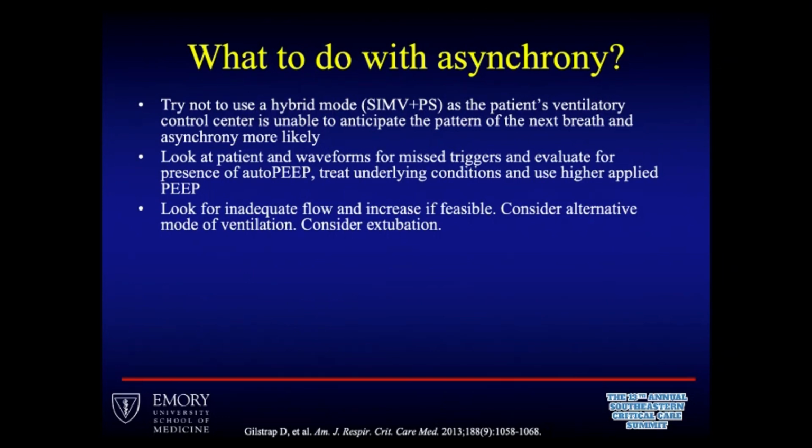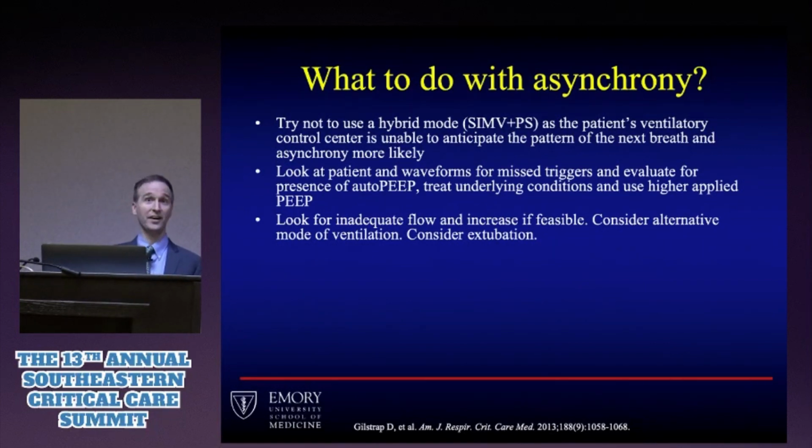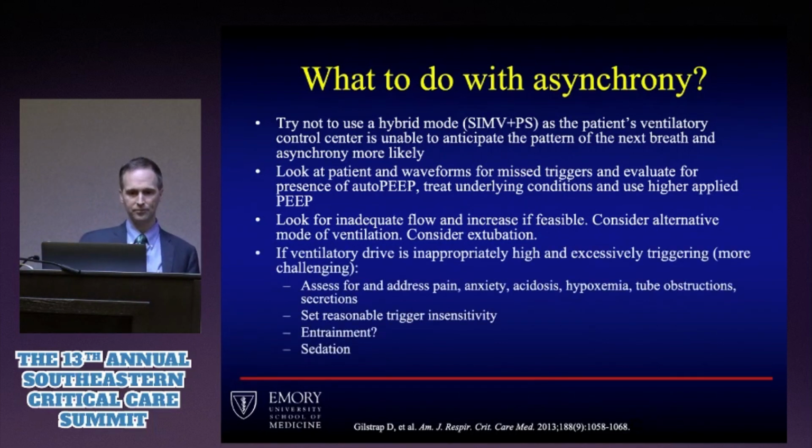The problem with changing any setting on the mechanical ventilator is that it changes other parameters of the breath that are being given, and you're essentially going to box yourself in sometimes to having a patient either have cycling dyssynchrony or having flow dyssynchrony. And it can be very hard to overcome. You want to sedate the patient, but sometimes they're ready for extubation, actually. They're ready to breathe, they're better, and actually consider extubation, see if they're ready.